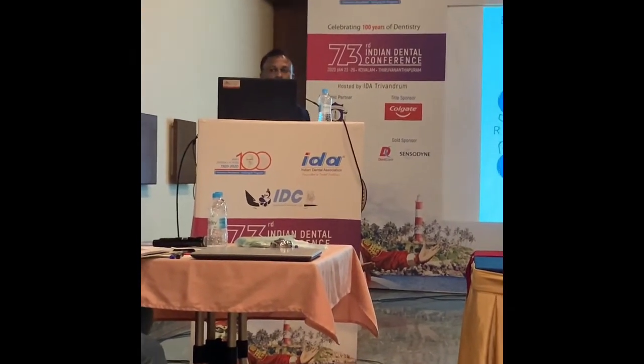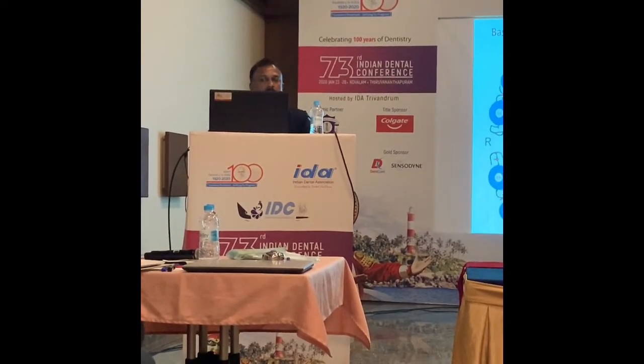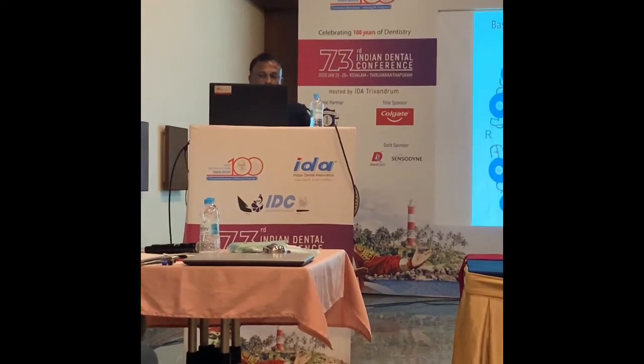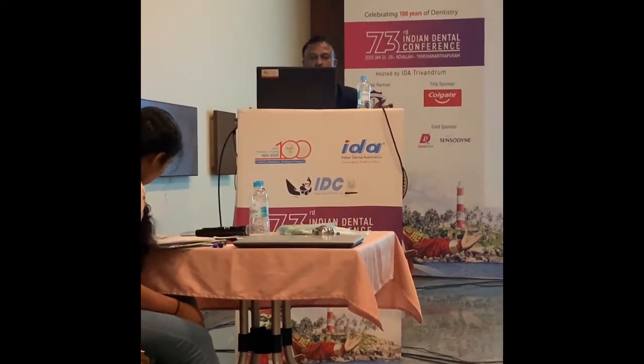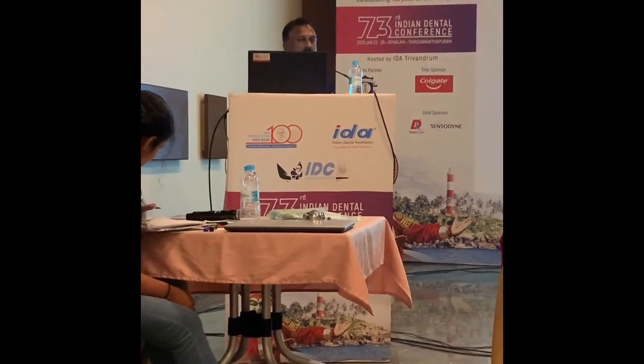So the basics for fixed prostheses: there are 4 main buttresses, that is the main area where we have to work. The ideal implant diameters and other things I have put, and for narrow ridges you can put 3.25. There are some basic concepts you can have. The canine region is always used, since the canine has got a longer root. So the implant requirements are as such: 1 missing tooth, 1 implant; 2 missing teeth, 2 implants. This is the order of these things. And when you go for full mouth rehabs, you can have 6 implants or 4 implants, or sometimes if the bone is more, 8 implants.